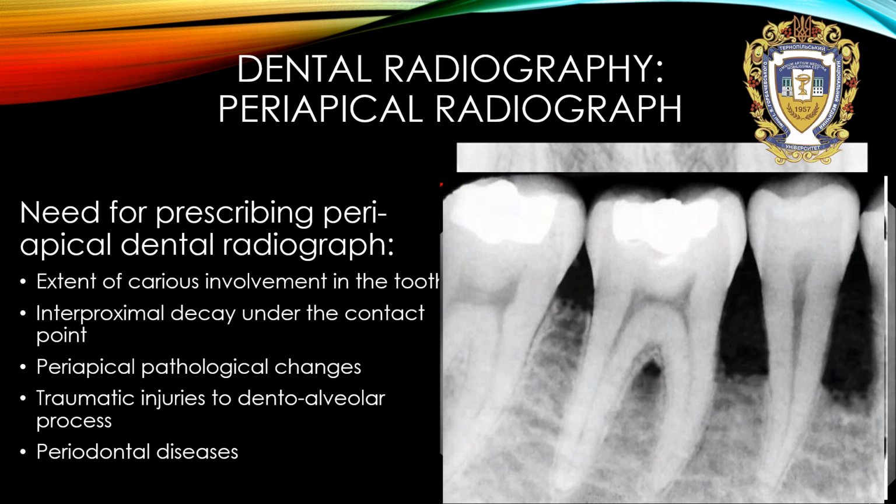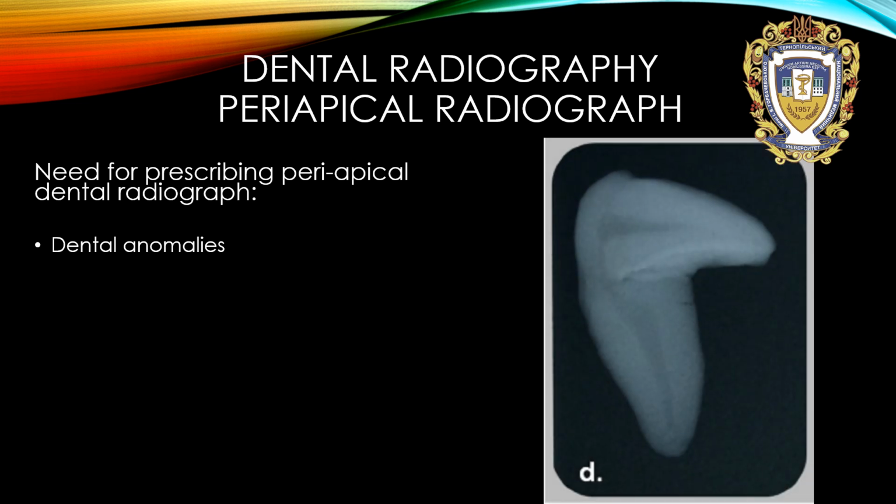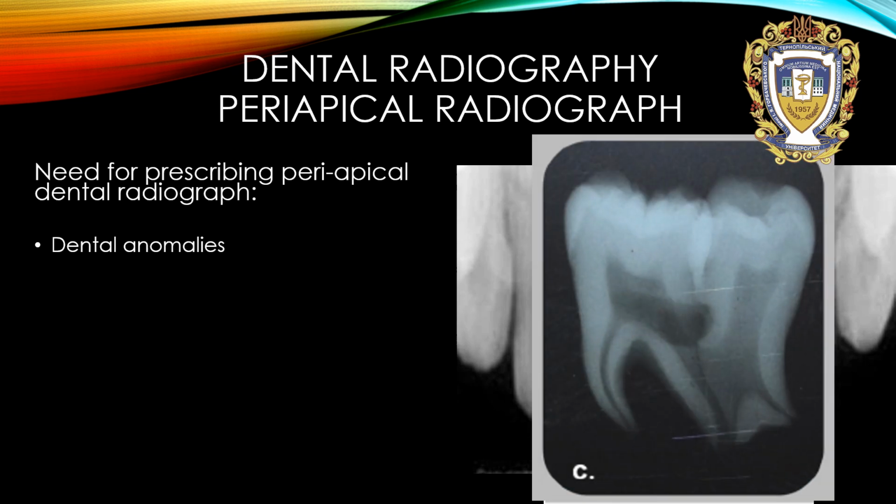As you can see, a low level of bone and resorption. Next indications, dental anomalies, like this, ingrown teeth, or here, double tooth, or here, two ingrown teeth.